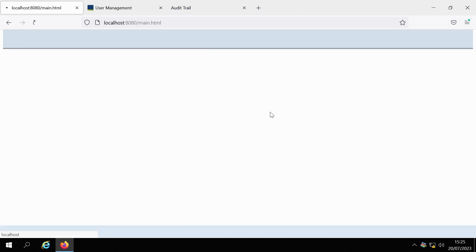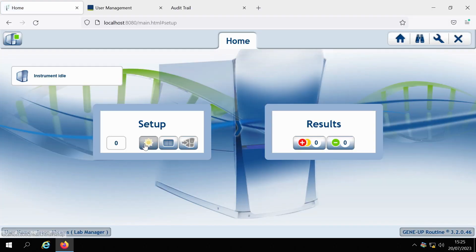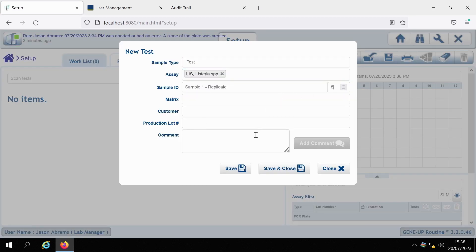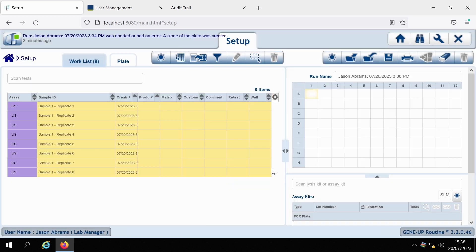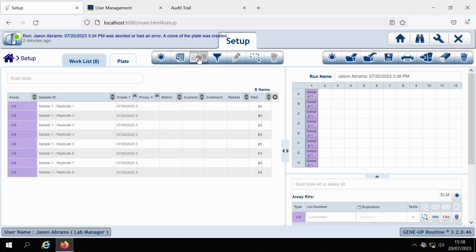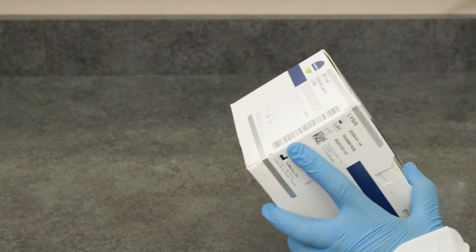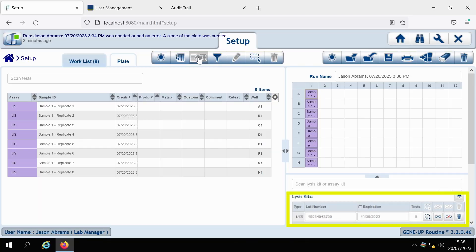Before we begin, you will first need to create a sample work list. Once the sample work list has been created, click on the Auto Plate button on the Work List icon bar. The plate map will update to include your samples; then name your run. Click on the box to scan the lysis kit located below the plate map. Remove the lysis kit from the storage area and scan the barcode of the lysis kit. The lot number and expiration date will automatically populate the fields.